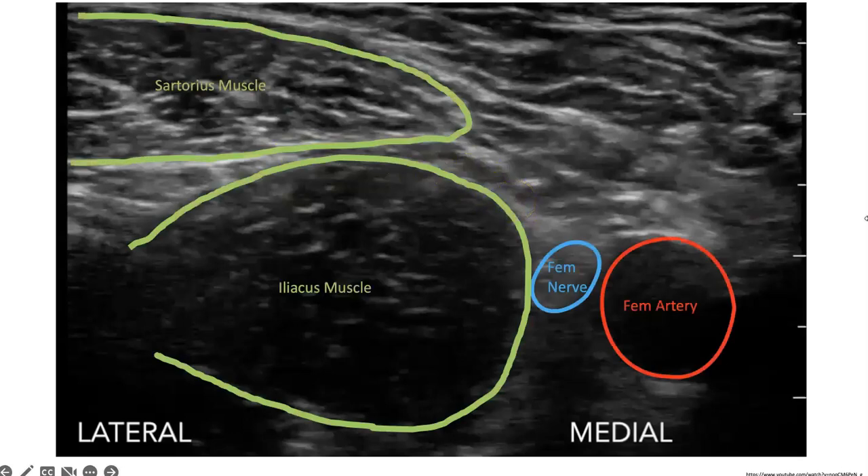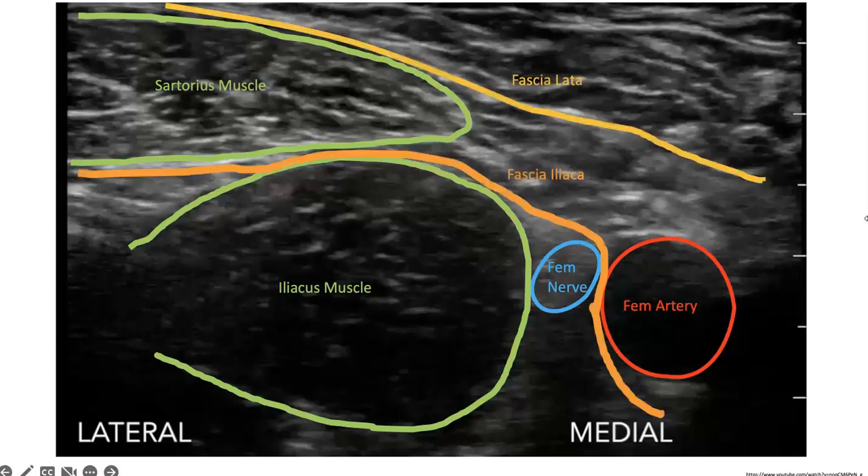Here I have an image with those structures labeled on the screen, showing the fascial planes labeled as well. When doing the procedure, we bring the needle in from the lateral aspect of the patient, often going through the sartorius muscle and advancing the needle tip just beneath the fascia iliaca.